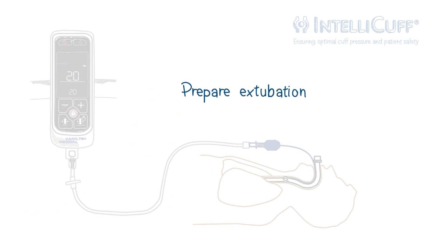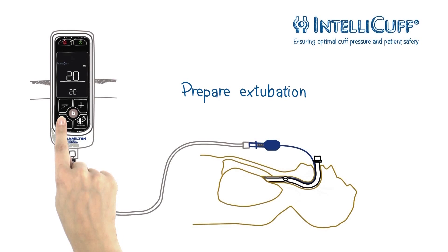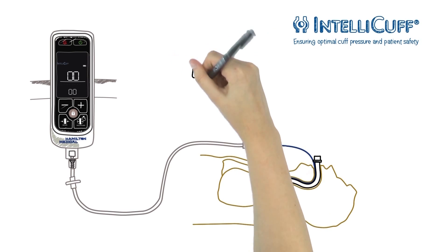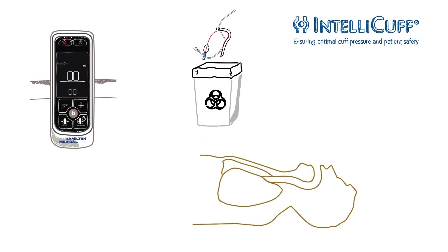IntelliCuff deflates the cuff on command. Long press the deflate button. The device beeps and displays the deflate icon to indicate that deflation is in progress. As soon as the current and target pressures are at zero, the patient can be extubated.